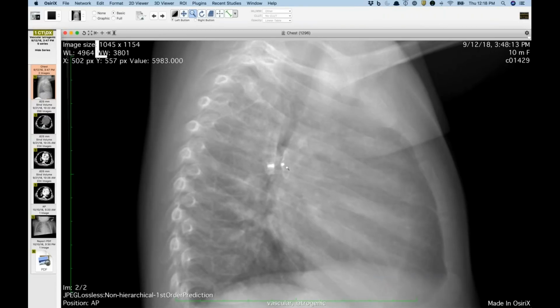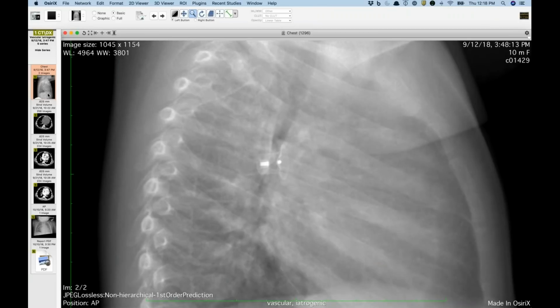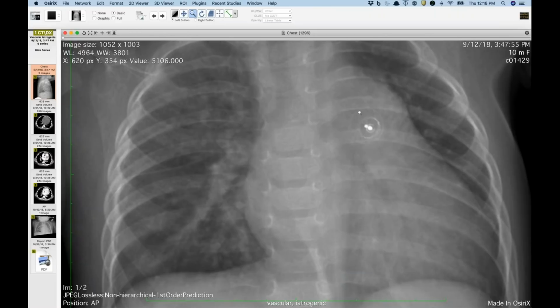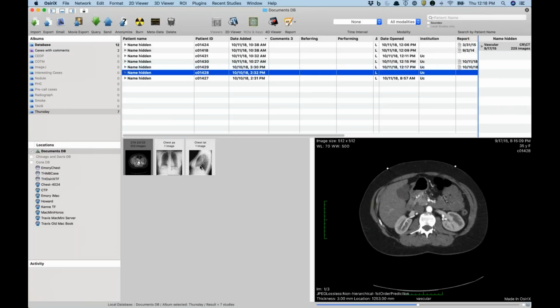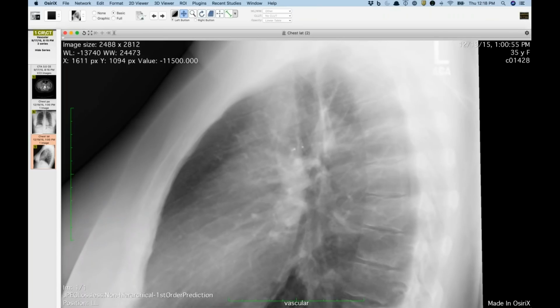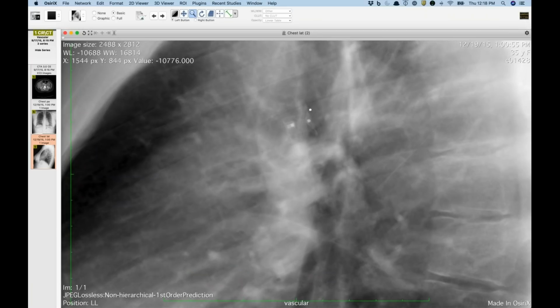One thing I will point out is that the larger portion of this device is pointed anteriorly. And if you look at the PA view of the radiograph, certainly it looks like it could be in a reasonable location, but if the aorta is up here, you expect the PDA to be right in here. And this is all in retrospect. I'm going to go to this next case and come back to that, because I found an appropriately positioned PDA closure device. I will show you on the lateral view that the wider or broader portion is supposed to be in the aorta, so it's the more posterior portion.